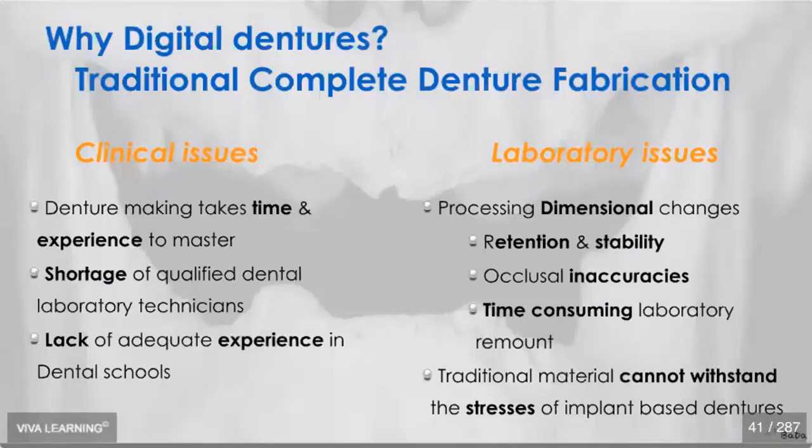So traditionally, the material, the PMMA, cannot withstand the stresses of an implant-based denture. So there was a need to create something that is stronger and that could take the load that is created by the implants on these materials.